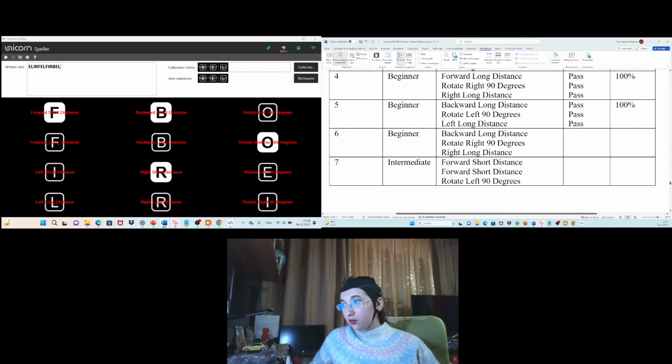So the 6th experiment, the last one for beginner, we also have 3 commands: backward long distance, so this one, then rotate right 90 degrees, and right long distance. So backward long, rotate right 90 degrees, and right long. I won't check them again to see that this is still possible.